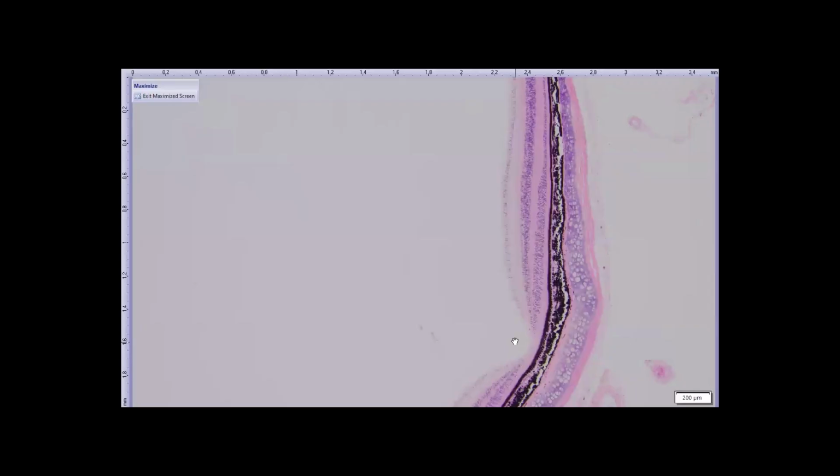In this fovea, the outer nuclear layer is discontinuous, which seems counterintuitive. Shouldn't there be photoreceptors in that pit? I guess there are outer segments. I won't claim to be the one who can answer the question of whether there should be or shouldn't be something. I agree with you. It's discontinuous there.